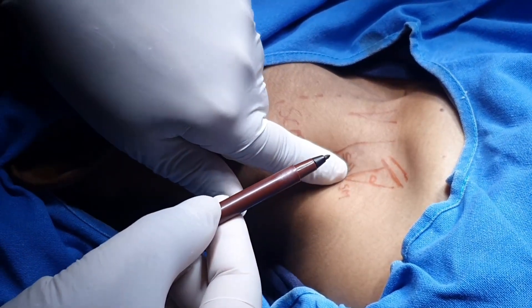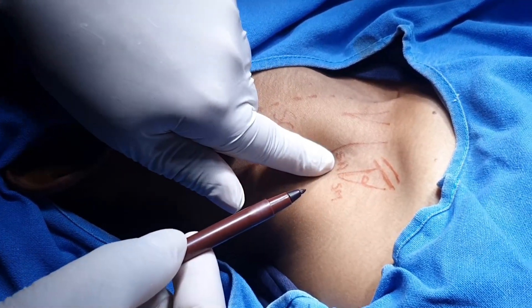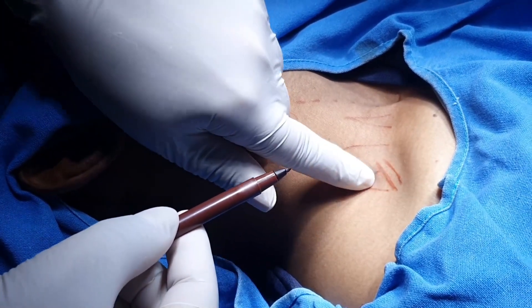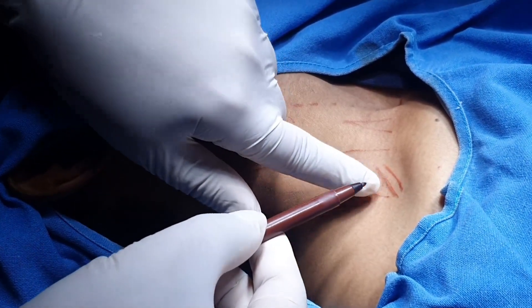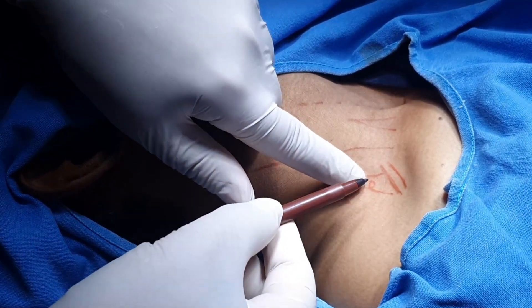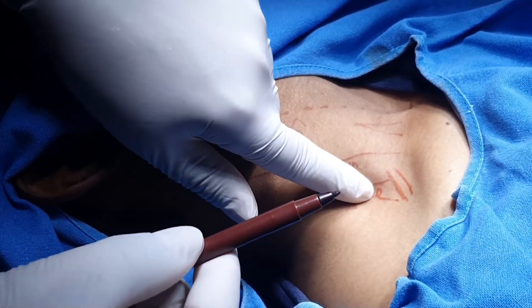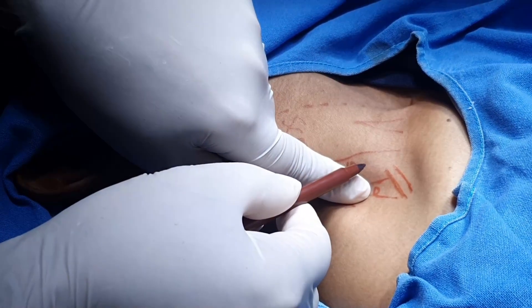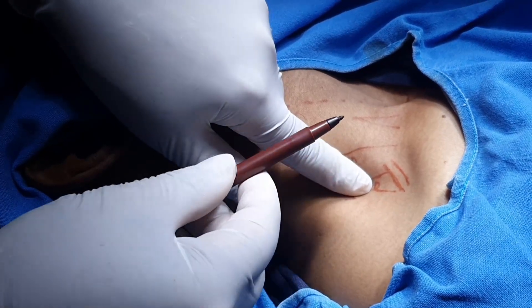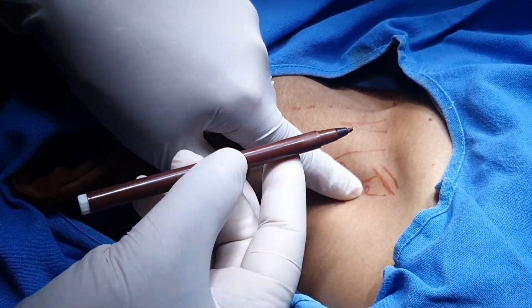If I put the finger on this and roll it laterally, it is just over the scalenus anticus; further, the tip of the finger dips into the cleft between the scalenus anticus and scalenus medius. Now rolling the finger down, the inferior belly of the omohyoid is felt. The point of entry is just above the inferior belly of the omohyoid in the interscalene cleft. We press this cleft to keep apart the scalenus anticus and scalenus medius so the linking membrane between the two muscles becomes quite taut, and we will insert the needle here and instill nearly 15 to 20 ml of solution in an adult.